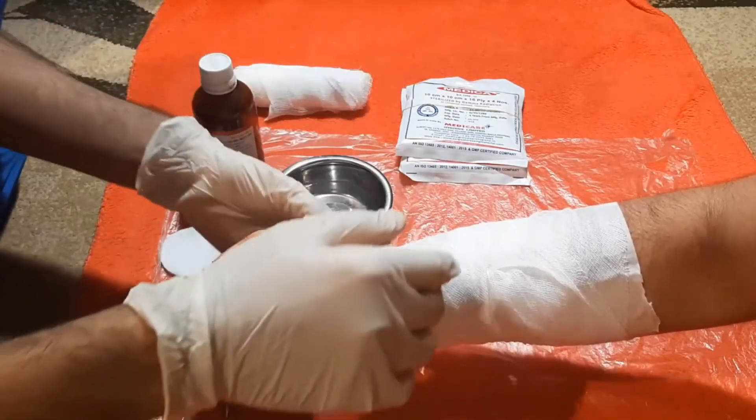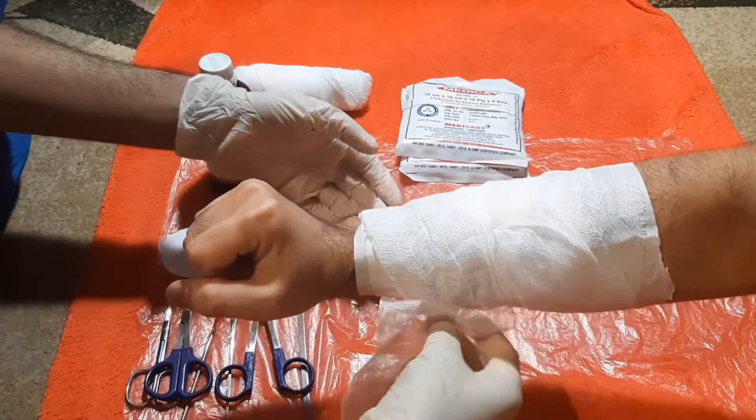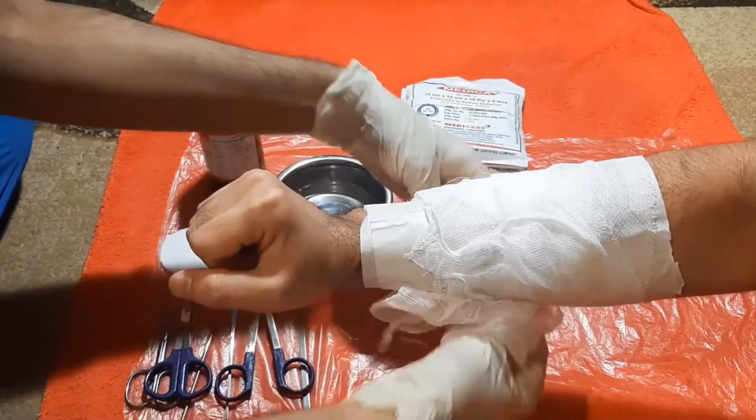First, we wear a pair of clean, sterile gloves. We begin by carefully removing the bandage and dressing.